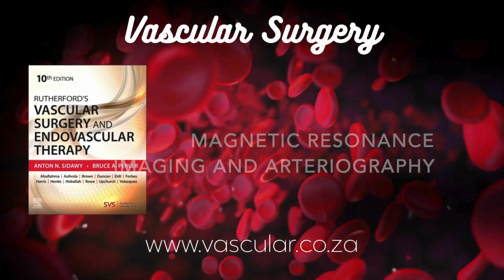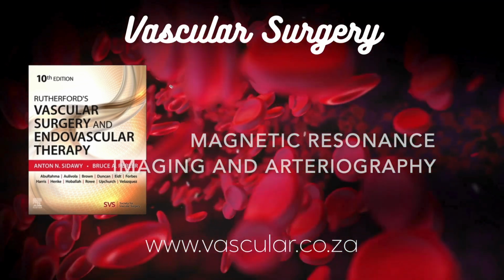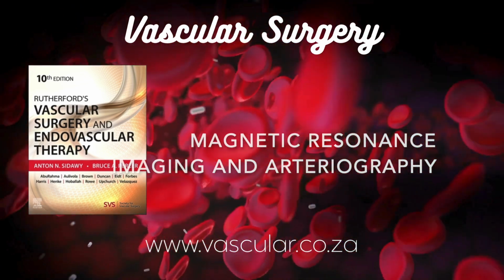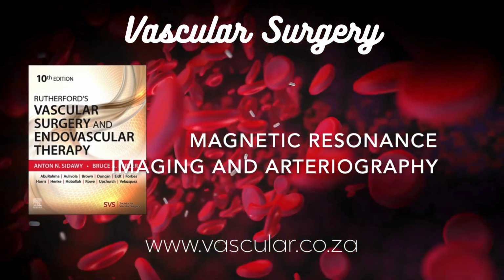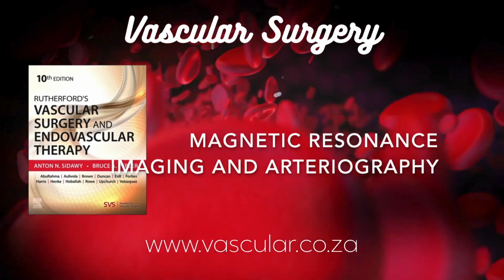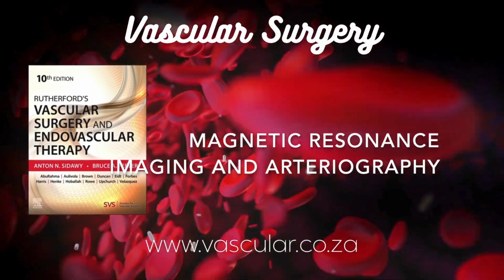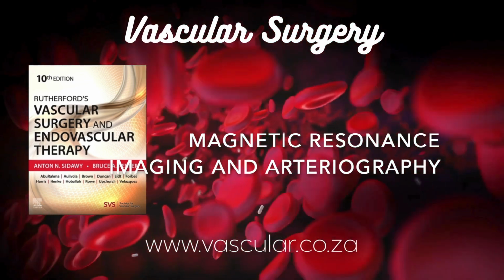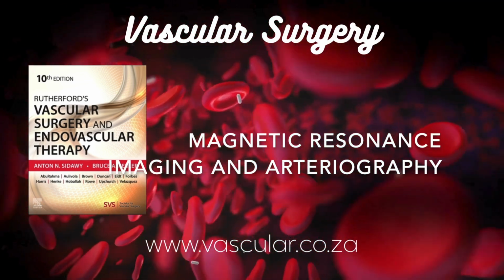Renal vascular disease? 3D gadolinium enhanced MRA is pretty much the clinical standard now for looking for renal artery stenosis, narrowing of the kidney arteries, which can cause high blood pressure. Mainly atherosclerosis. That's the most common cause, yeah, especially near the artery's origin. But MRA is also good for other things like fibromuscular dysplasia, FMD, which often affects younger people, renal artery aneurysms, and spotting accessory renal arteries.